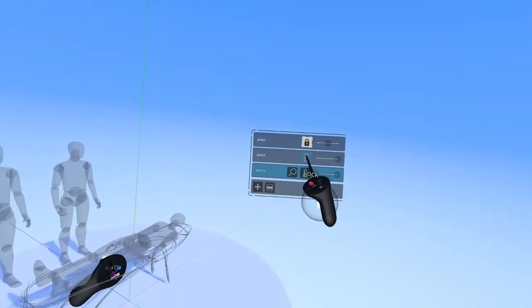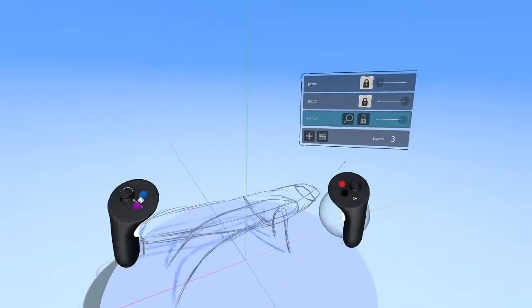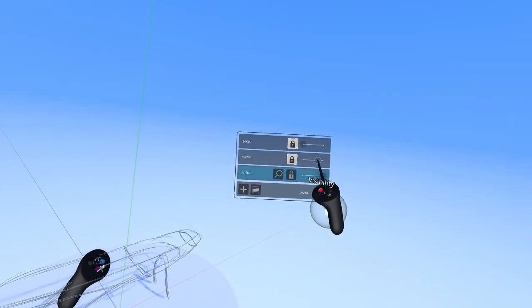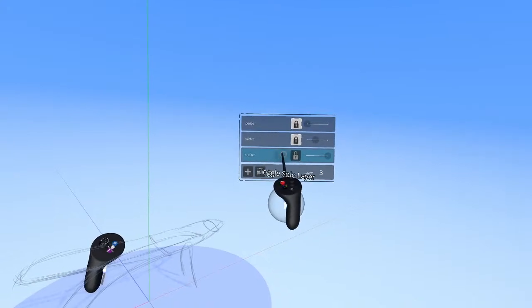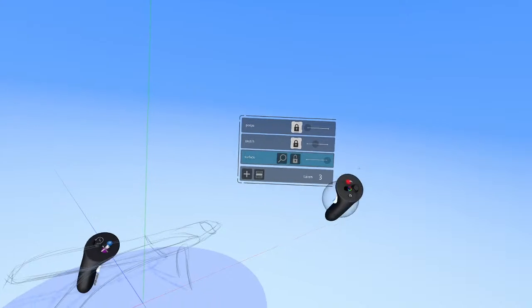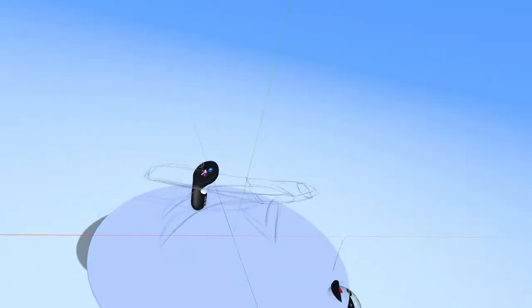And we're going to lock the sketch layer, turn down the people layer all the way so that we're just focused on the table for right now, and then turn down the visibility on the sketch just a little bit, just enough so that we can reference it still. And of course, make sure that the eyeglass layer is on the active layer that you want. So in that case, it's the surface layer. And yeah, now we're going to start to construct this table.